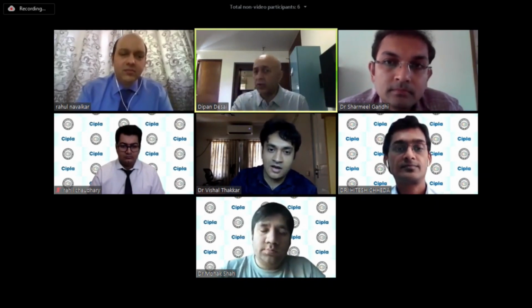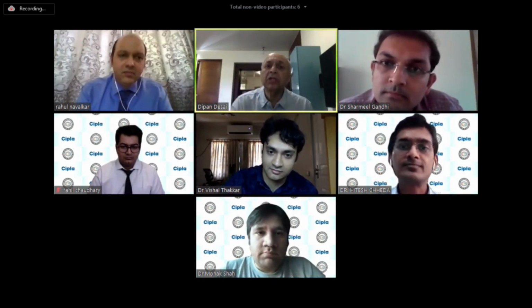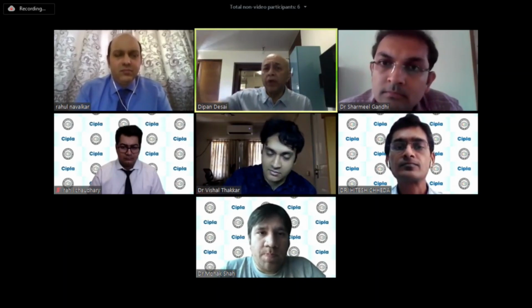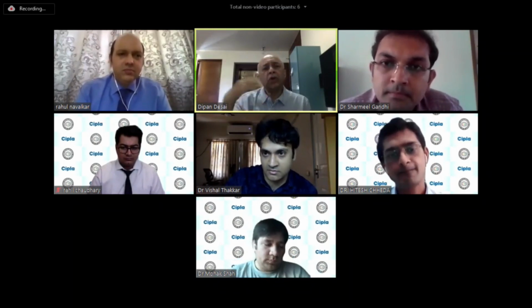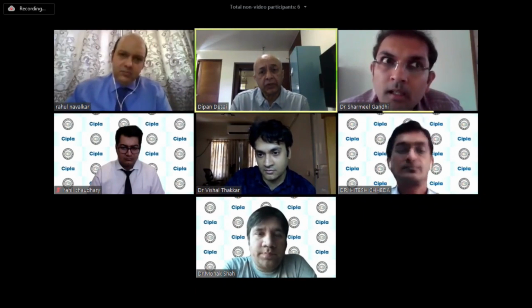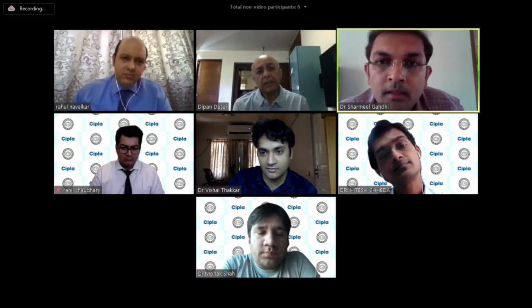Now, Sharmil, I'm not saying you are not a fantastic surgeon, but sometimes when we are giving incisions, especially the clear corneal incisions, we do not get a definitive correction. You will be 0.25 down or 0.5 down or 0.75 down or even 1 down. And it all depends on so many factors. So is the pre-operative and post-operative case measured or something? I don't remember the case exactly right now, but I will of course share it on the group if I come across it again.